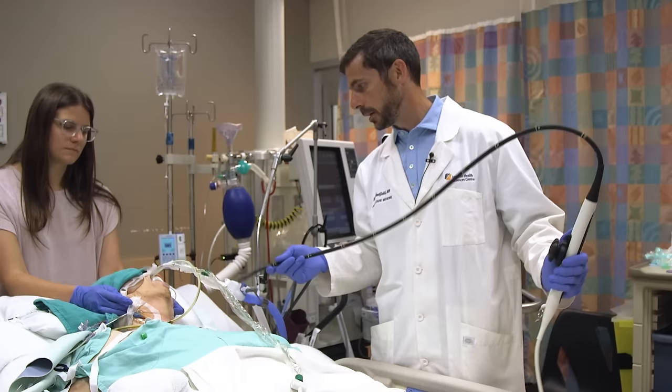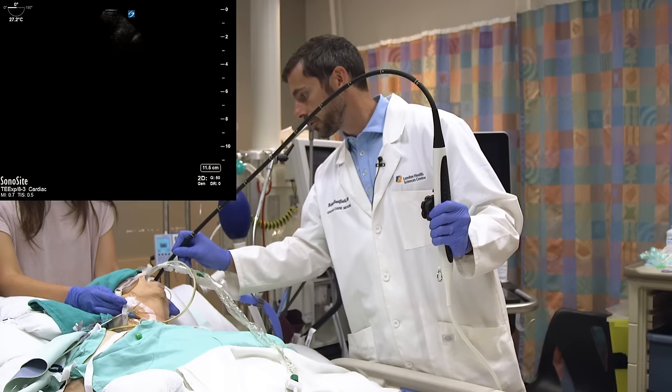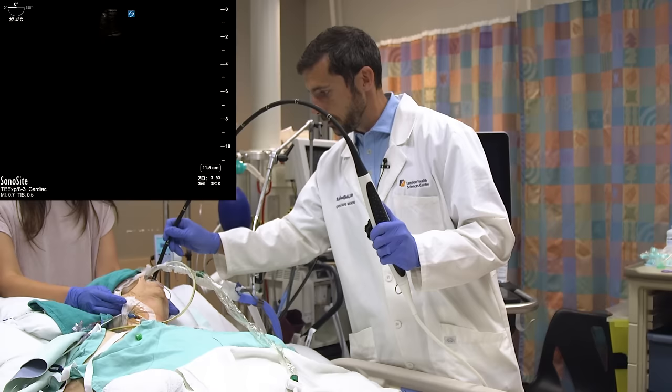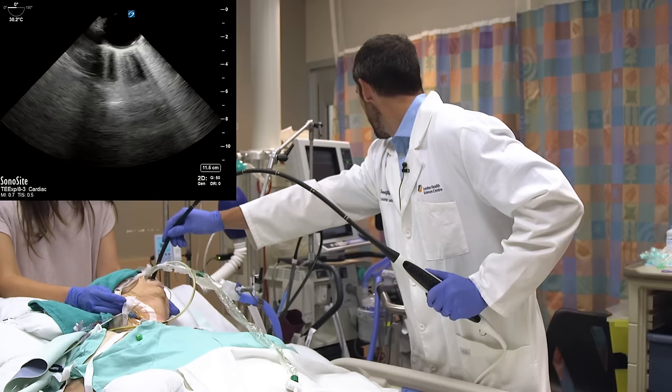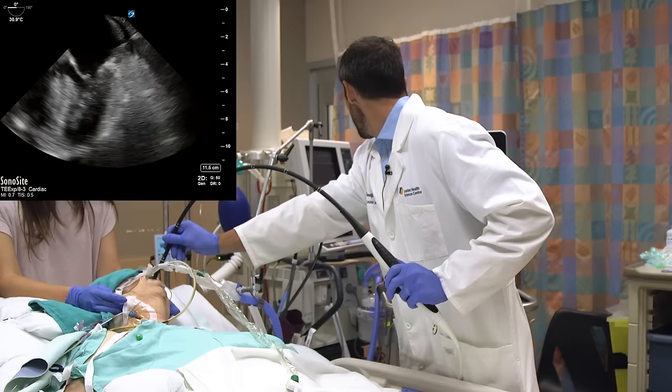We'll start with probe insertion. With the help of a trusty assistant, we will find the midline of the mouth and slowly insert the transducer with the help of a bit of a jaw thrust. We find some resistance halfway through the oropharynx, then successfully pass it. As I advance down, I'll actually pass through the great vessels in the short axis, and eventually the heart in the mid-esophageal four-chamber plane will come into view.